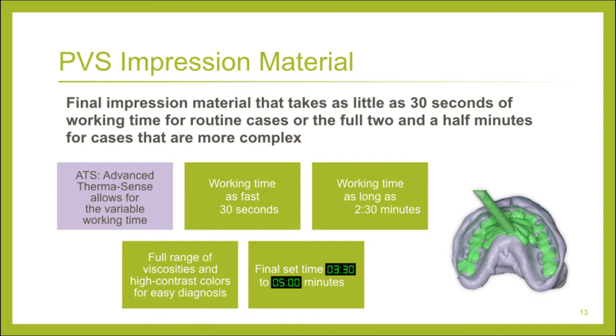And that's actually all we need, because a lot of times we say in dentistry, wow, this takes too long. So the beauty of the products that we like to use is that when we place it in the mouth, the warmth of the body is going to accelerate that setting time to get us to where we need to be.